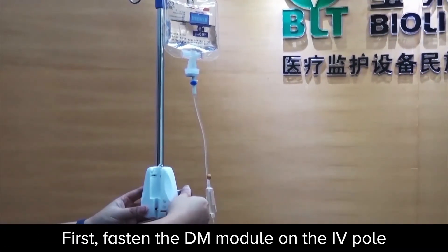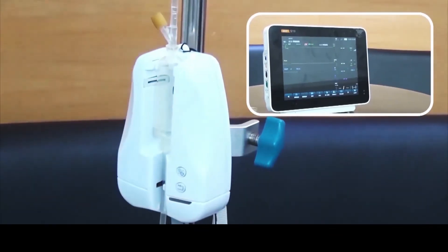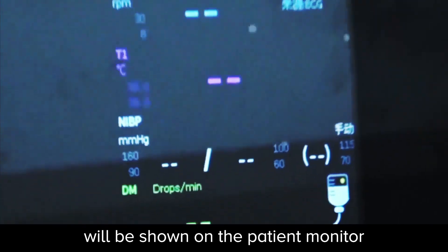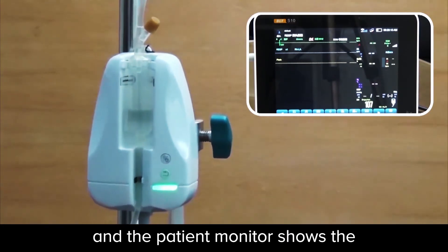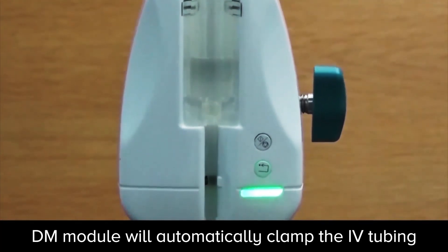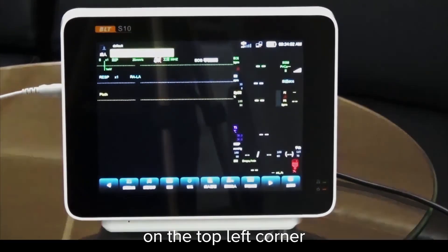Firstly, fasten the drip monitor module on the IV pole, then put the drip chamber into the module. Connecting the module to the S-series patient monitor, you will see the yellow light is on and the DM parameters will be shown on the patient monitor. Adjust the drip speed through the roller clamp — the green light on the module will flash according to the drip speed, and the patient monitor shows the corresponding drip rate at the same time. After infusion completion, the DM module will automatically clamp the IV tubing and the blinking light turns yellow. The red infusion completion sign on the monitor will keep flashing while the patient monitor raises the yellow alarm, with an alarm message of 'DM completion' on the top left corner.